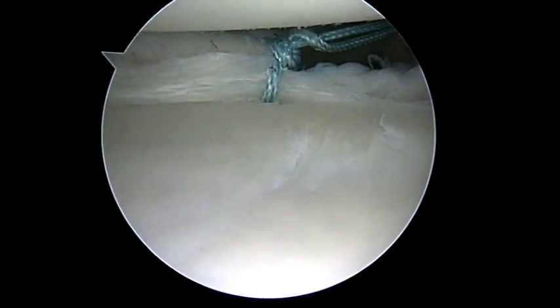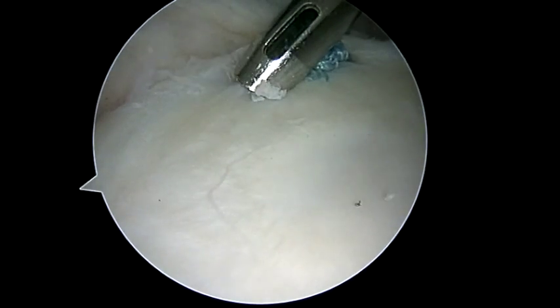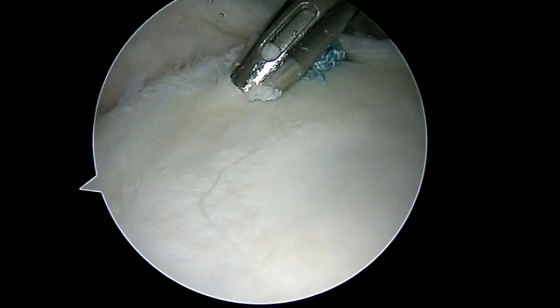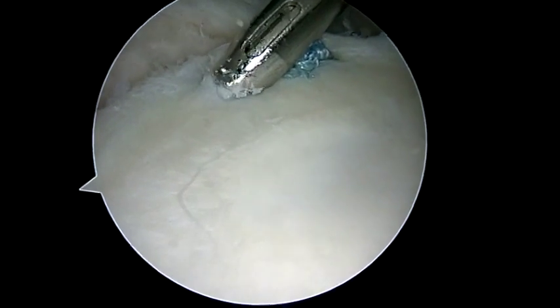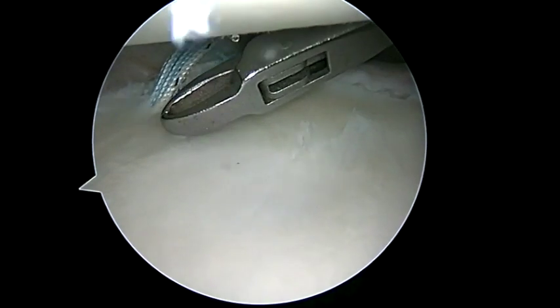This is achieved with a 45-degree right Spectrum placed through a 7 o'clock portal. Then, the spear for a 3 mm double-loaded biocomposite suture anchor is placed through the subscapularis tendon and an anchor is placed at the 6 o'clock position. The anterior portal is used for suture management.